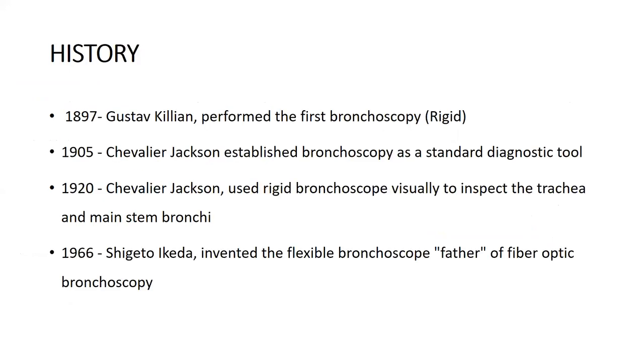Let's have a brief history of bronchoscopy. In 1897, Gustav Killian performed the first rigid bronchoscopy to remove a pork bone. Chevalier Jackson established bronchoscopy as a standard diagnostic tool in 1905, and in 1920 he used rigid bronchoscopy to visually inspect the trachea and mainstem bronchi. In 1966, Shigeto Ikeda invented the flexible bronchoscope, and he is considered the father of fiber optic bronchoscopy.